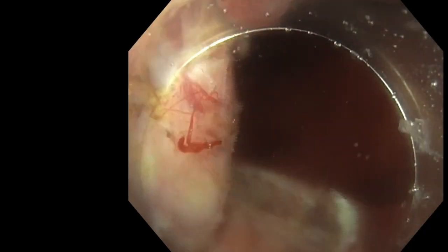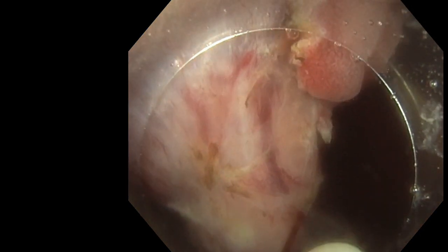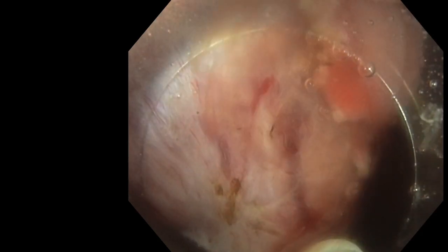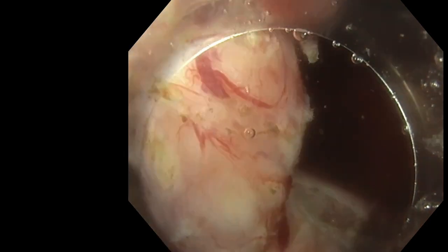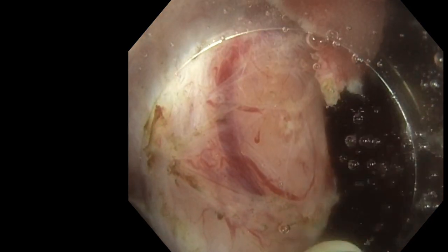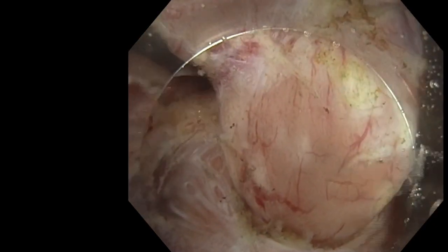So once again, I try to turn around. I'm very cautious here because I don't want to damage the mucosa.